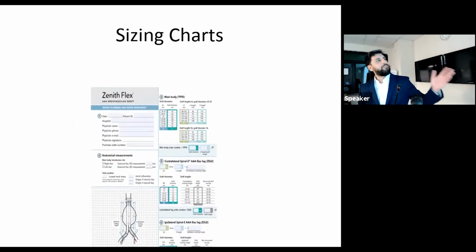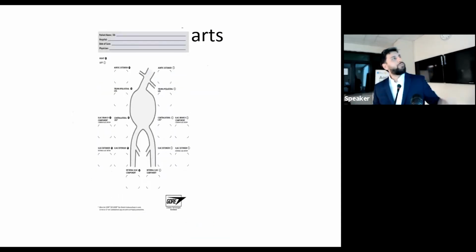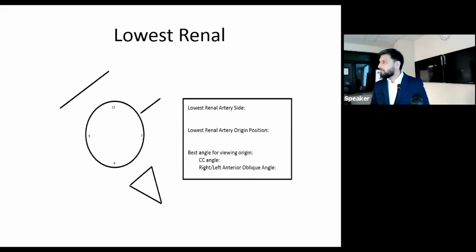These are the sizing charts, Endurant by Medtronic. These are the usual suspects, the main ones that we use. Zenith Flex by Cook, and of course Gore, which unfortunately isn't available in Pakistan, but those are 3 very commonly used kits.